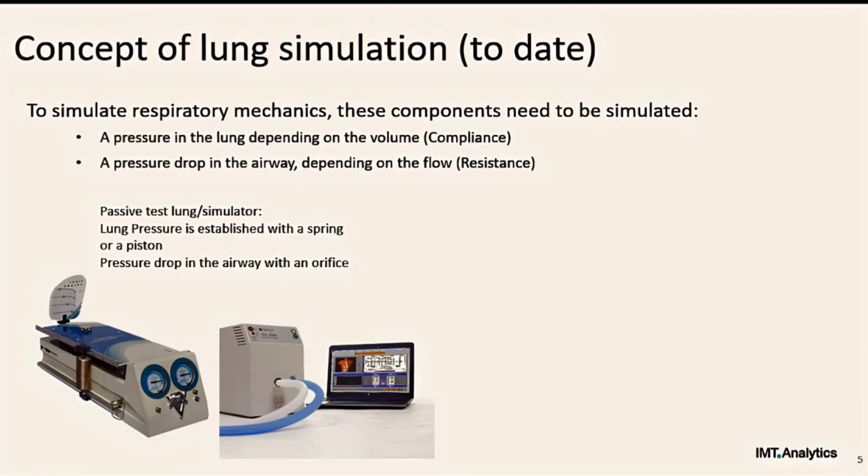You can adjust this very, very accurately, and this works, but this all has contained volume, and so leakage and other things are not easy to simulate, because the air that goes in must somehow go back out again. And so the idea was to make it really, really different from any other simulator we have today.